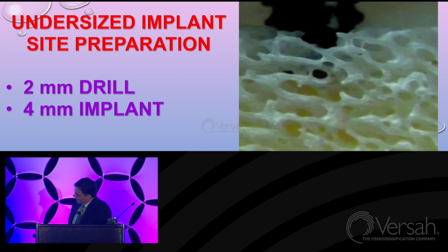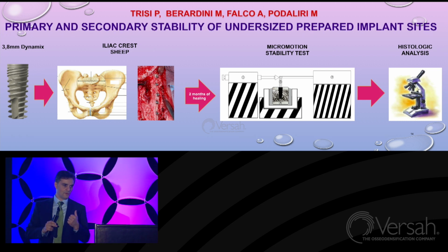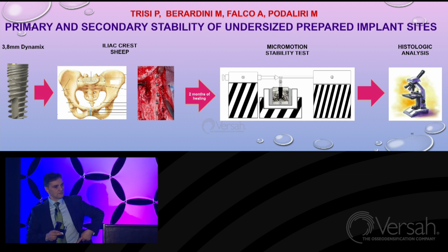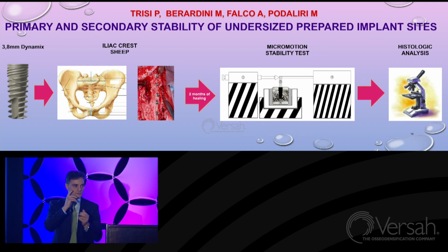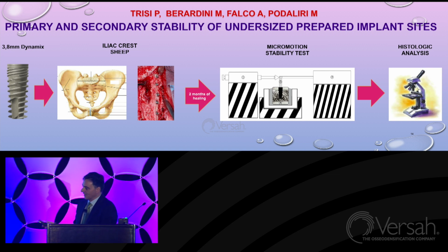This is the study, primary and secondary stability of undersized implant site preparation. We used the model of iliac crest, like Professor Coelho said before, because the density of the bone is quite similar to the density of the maxilla, which is the case where implant stability is most important. And we are using a different approach. Instead of placing implants in plates, we place implants directly on the crest, because the shape and the dimension of the iliac crest is very close to the maxilla shape, diameter, and density. So it reproduced quite well our clinical situation.